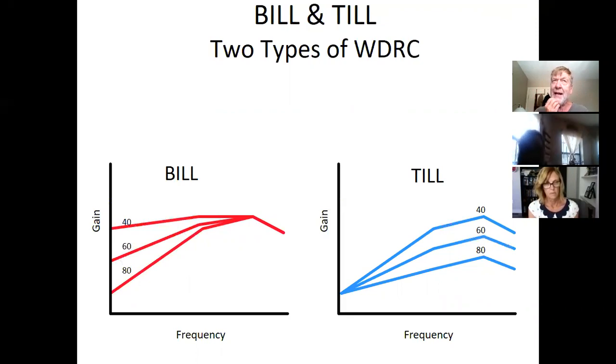Now that had a very intellectual thought or purpose, because people would say, background noise is mostly low frequency. High frequency consonants need to be heard. And lows mask highs better than highs mask lows. So we had better take El Toro, the bull, and bring that sucker down.